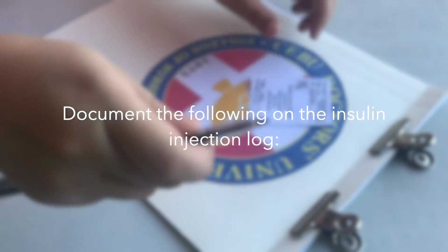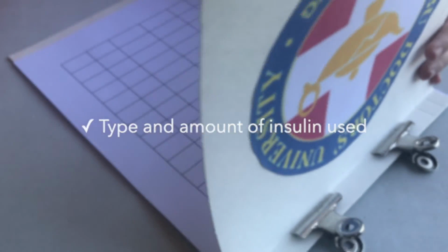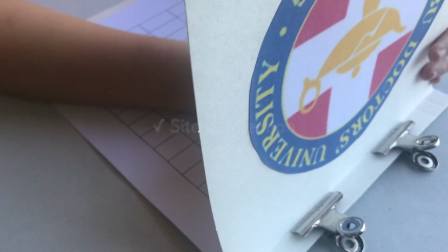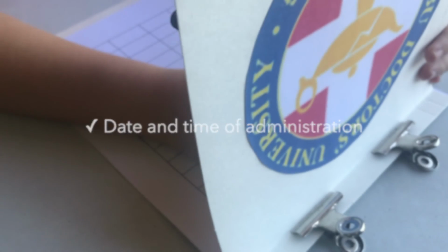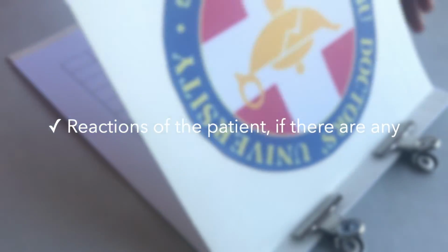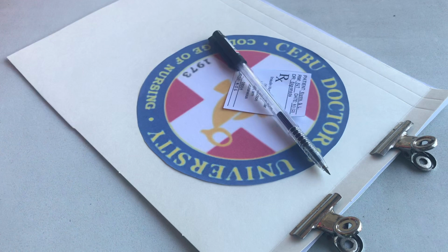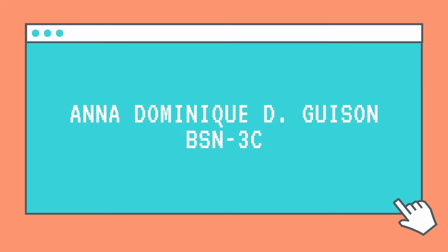Then, document the following on the insulin injection log: the type and amount of insulin used, site of injection, date and time of administration, route of administration, and the reactions of the patient if there are any. This is to have proper documentation of the procedure done and to serve as a reference to the other healthcare team. And that's it for insulin administration.